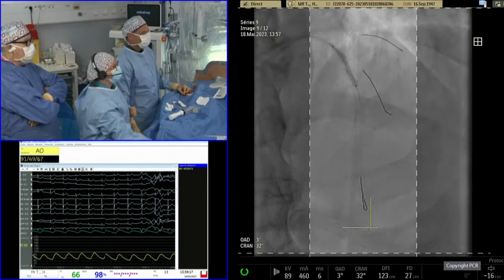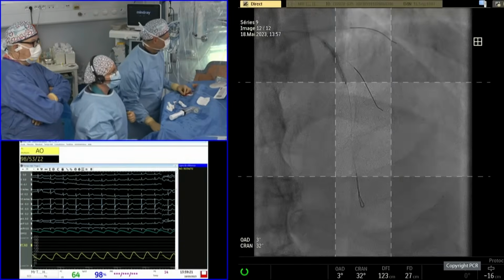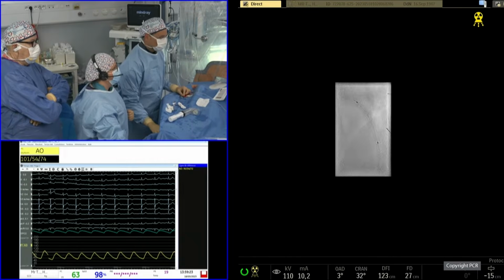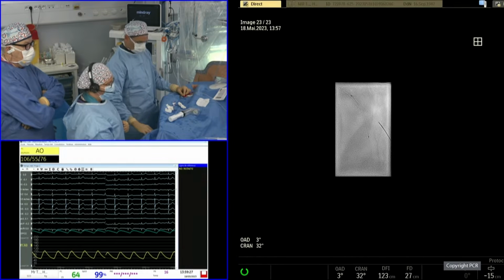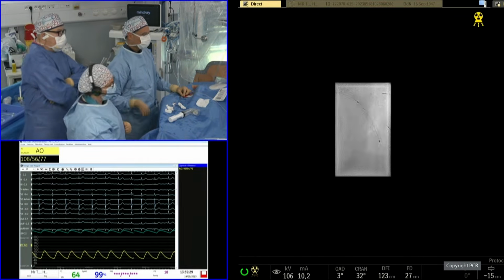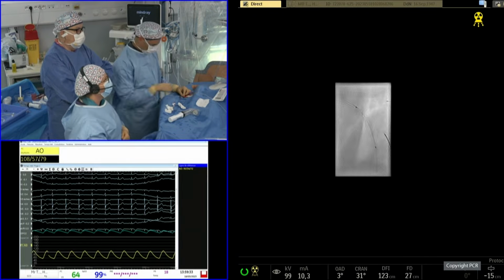So in terms of the diagonal, there's a comment here, anonymous, but do you consider it mandatory to wire both the circumflex and the diagonal? It's a provisional approach. Do we just keep it simple, one wire? I'm putting wire anytime I do this kind of procedure. I don't think there is, because the distribution is on the other side.